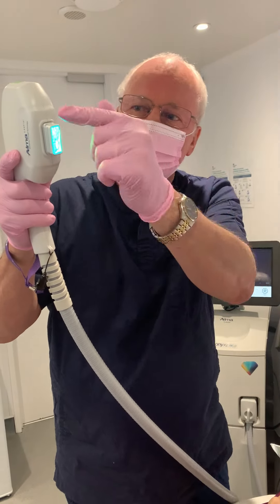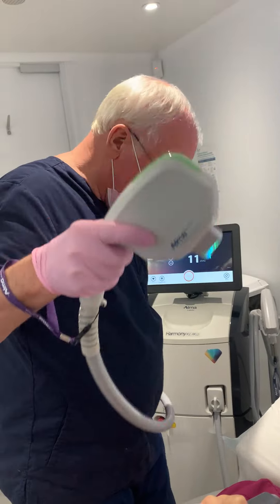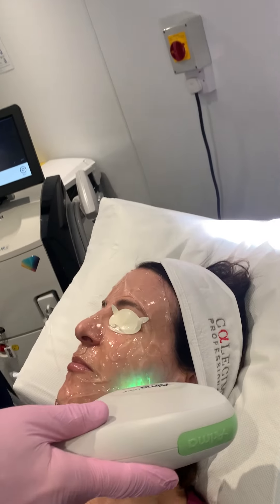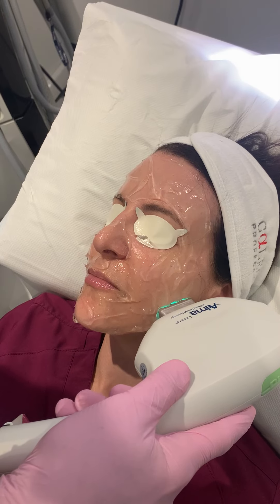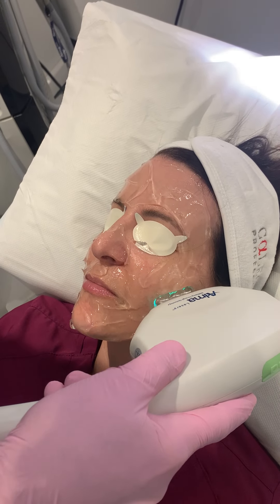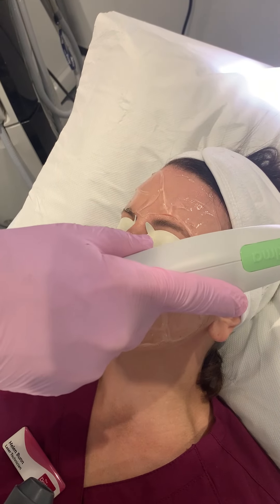This is our IPL machine — there it is, filled with green light. We put it in contact with the skin and there is a vicious flash. And we do it again, and again, and again, and again.